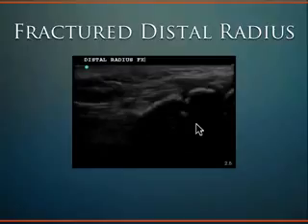So when you're doing an ultrasound, you put so much gel on it. You can get gel from the refrigerator. I always keep the bottle in the refrigerator. So you can put some chilled gel on there, and then you don't even touch the skin. The ultrasound touches the gel, and then it's actually painless to do an ultrasound for a fracture, as long as you're not moving the bone. Once you start moving the bones around, then the patient will let you know about it. For sure.